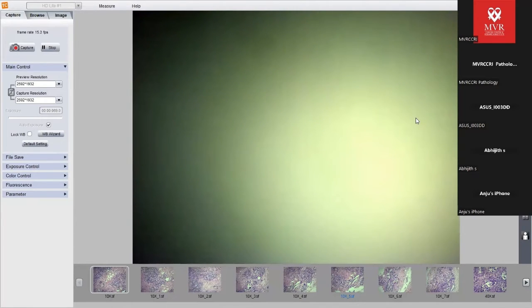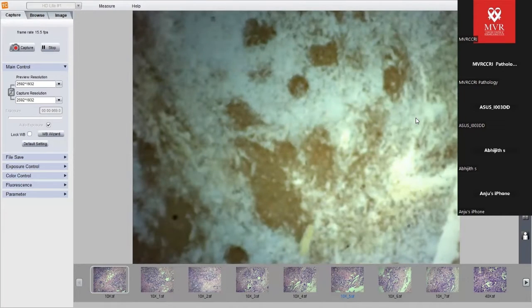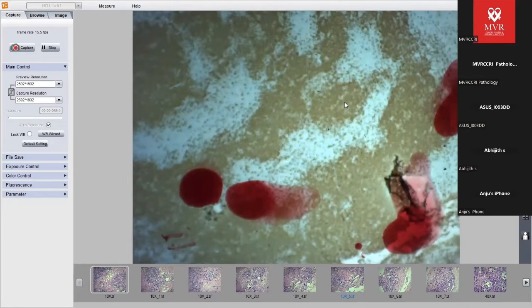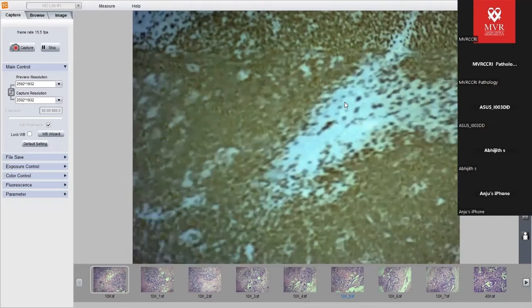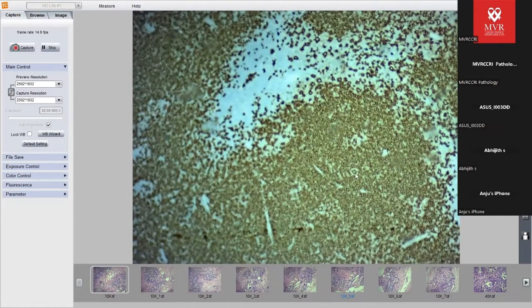For background, we like to see the background. We are told that it was lymphoid cell rich. So how was the CD20? With CD20, we are seeing nodules, serpiginous nodules, connected nodules, single nodules. And with CD20, you should actually look at those big cells, whether those big cells are positive for CD20 or not. And what do you think? CD20 positivity here.